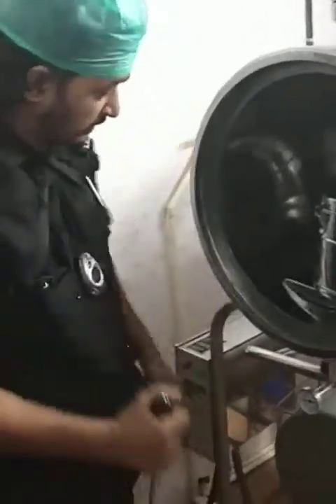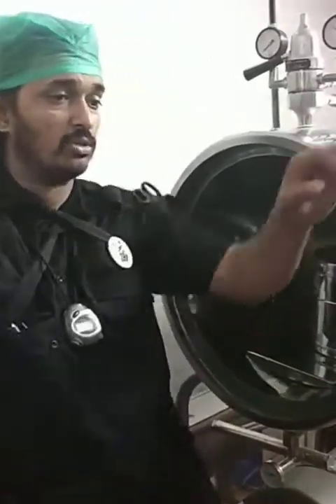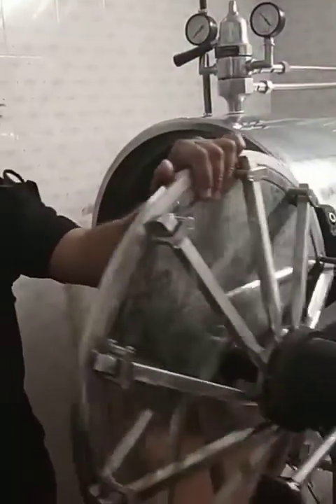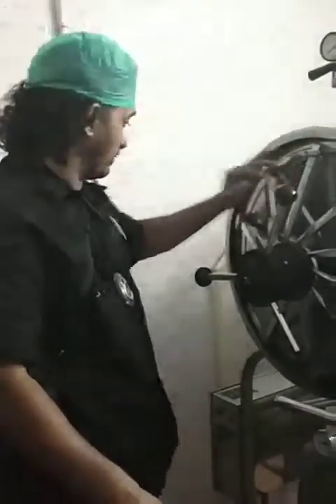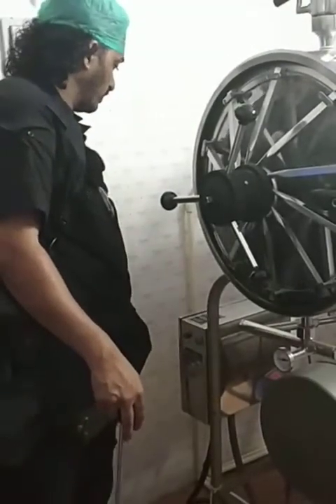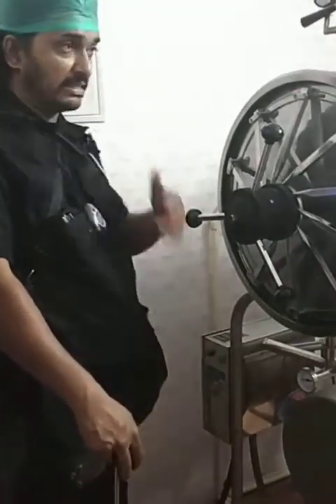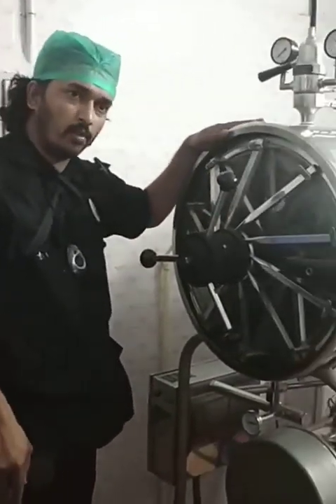So this is, in short, about the gravity displacement sterilizer or the high-end autoclave. This equipment is costly — it will cost you at least around 3 to 3.5 lakhs. It needs a three-phase power supply with an inflow of 440 volts, and if it doesn't get the three-phase supply, a lot of heat gets generated. So this is a high-end equipment.